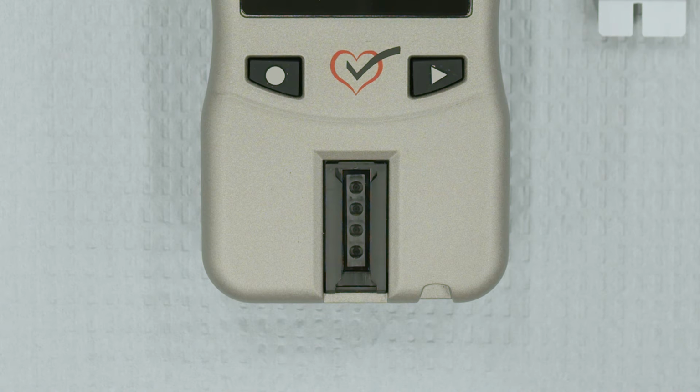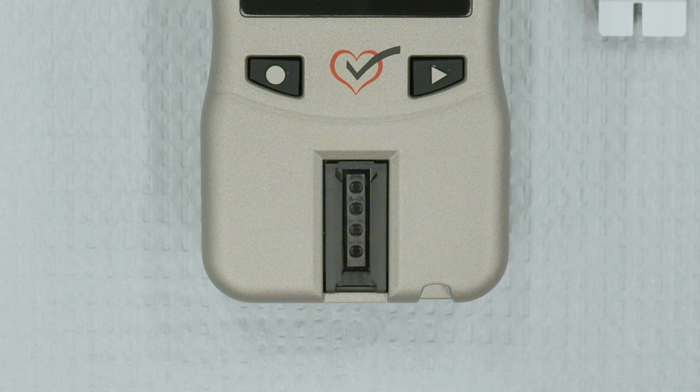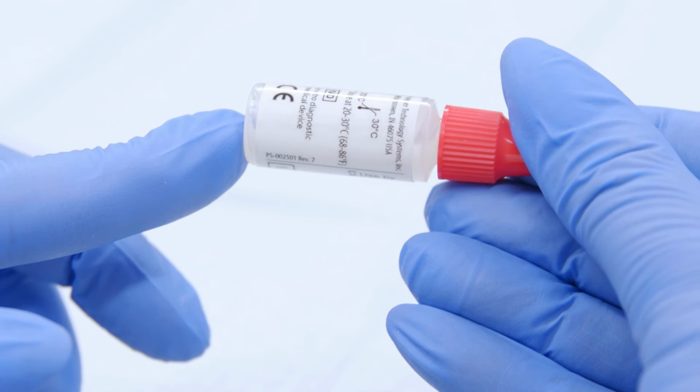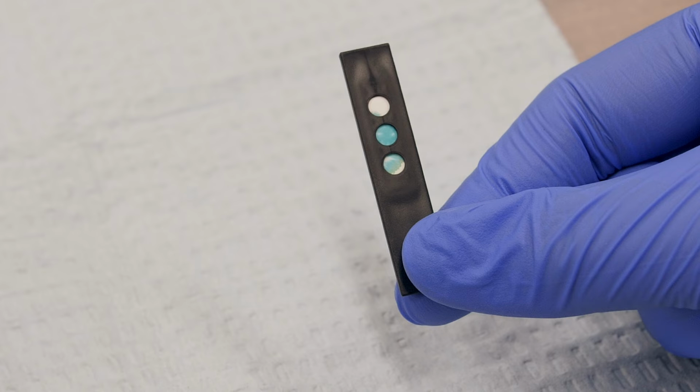If your Level 1 results are within range, press Enter to move on to the Level 2 control test. Use new test strips and the Level 2 vial of control solution. If your results are not within range, check the back of the lipid panel test strip to make sure that the 3 circles are completely colored. If they are not completely colored, you might not have applied enough control solution. See the Quality Control Testing section in the CardioChek Plus version 1.12 user guide for more troubleshooting tips.